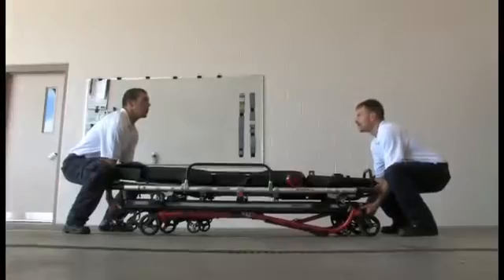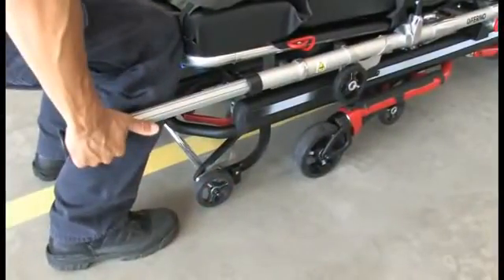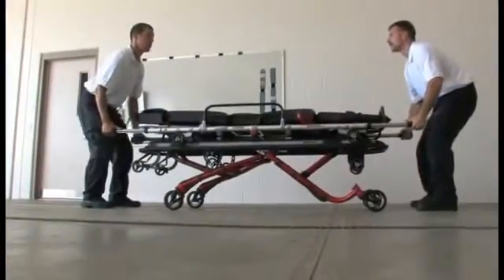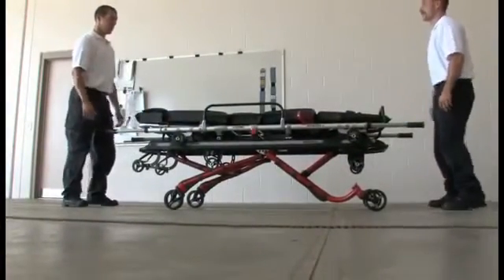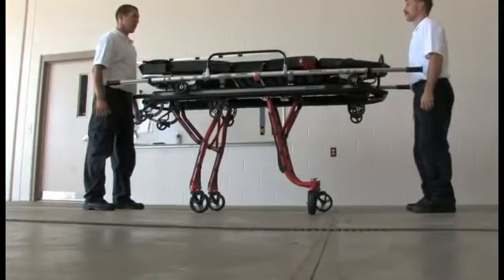Working together with your partner, grasp the transporter lift bars or the lift handles on the stretcher top and lift the transporter until it is at its desired height. The legs will ratchet and lock into position automatically.